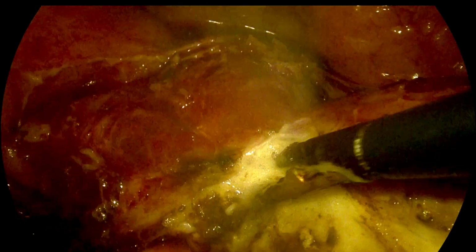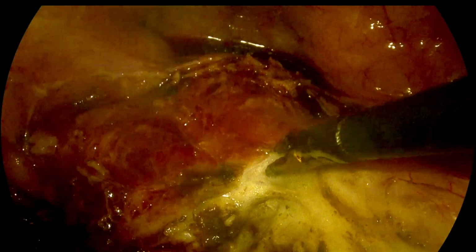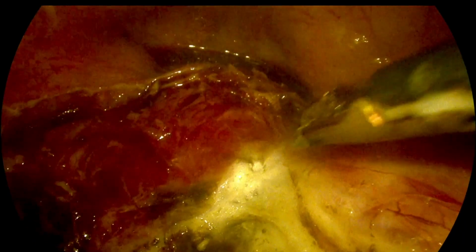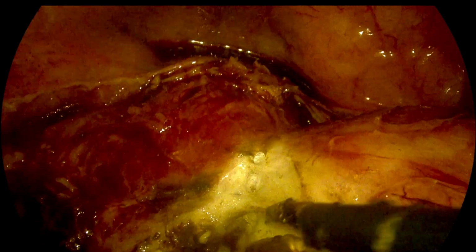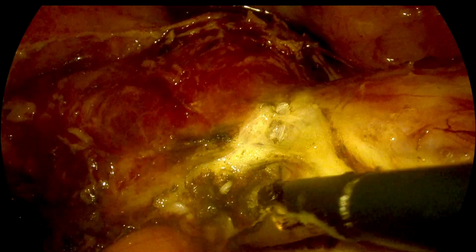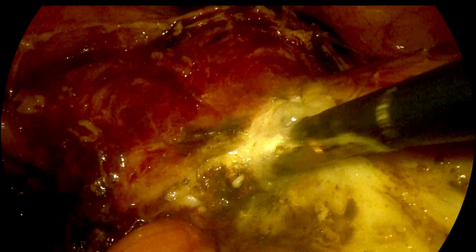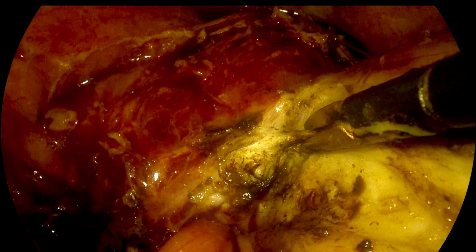We can see that we are coagulating more than dividing them. That is very, very important. Wait for some time before dividing the vessel. Coagulate, keep it for some time, and then try to divide. If any vessel is bleeding, it is better to identify it and coagulate immediately.